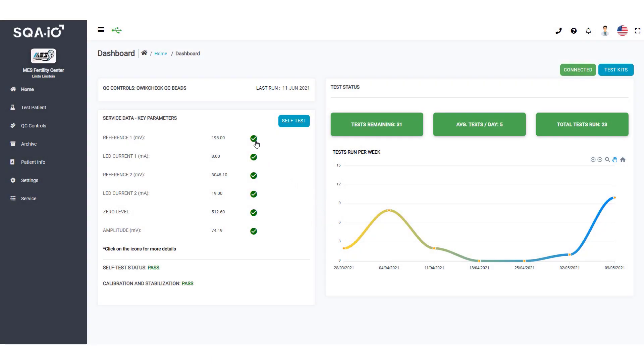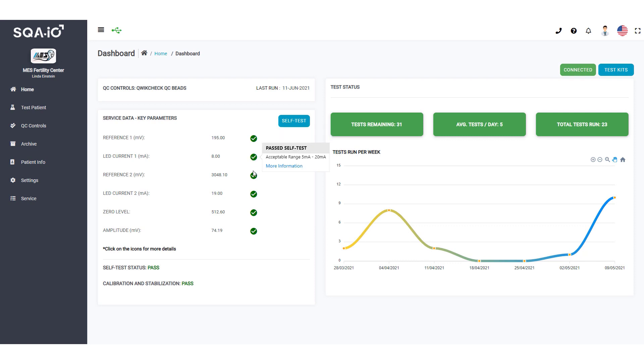Select your SQA-IO. Green icons indicate that your SQA-IO is in the acceptable range for optimal performance and is now ready for testing.